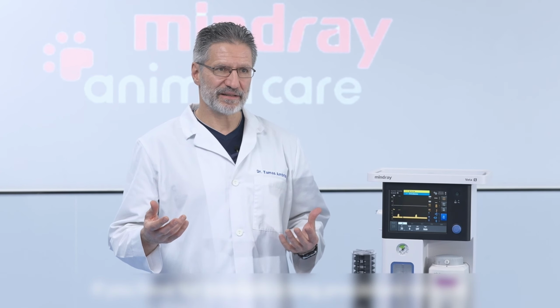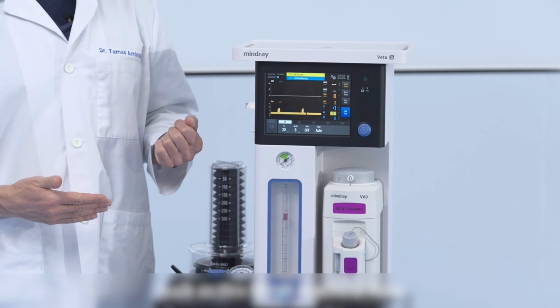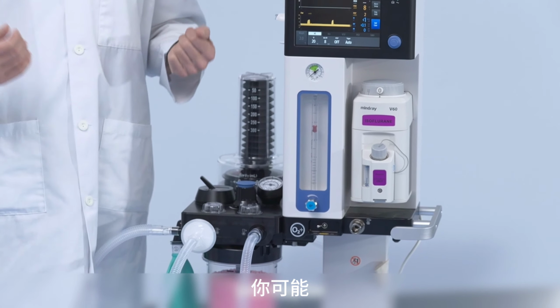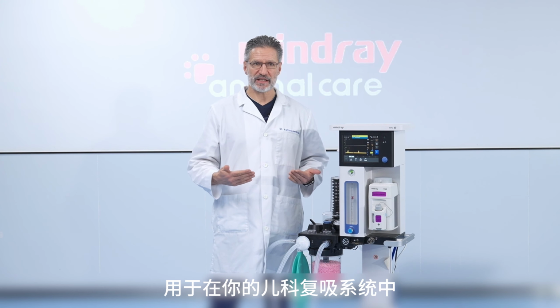If you have, for example, a long procedure on a cat and you have a mid to high end ventilator such as this Veta 5 machine here, then depending on the volume of the breathing hoses, you may be able to put a cat as small as 1 kilogram onto a pediatric rebreathing circuit.